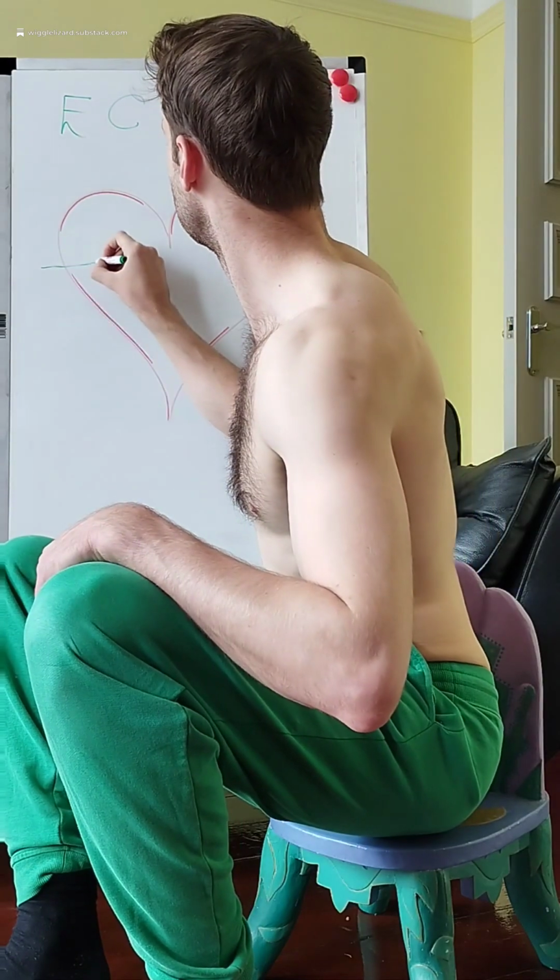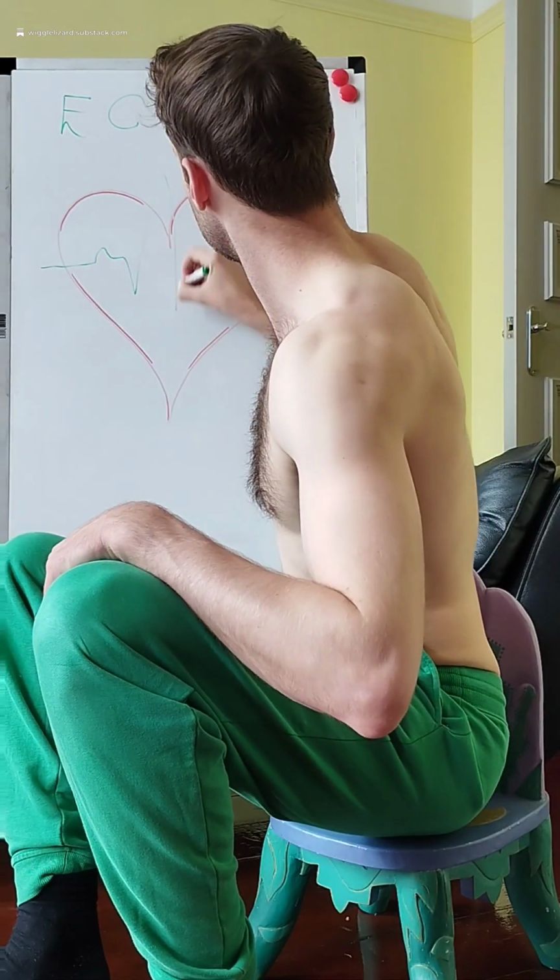So this is a heart, and this is an ECG. But what is an ECG? An ECG is a visual representation of how your heart is contracting. So we can see it without having to see the heart.